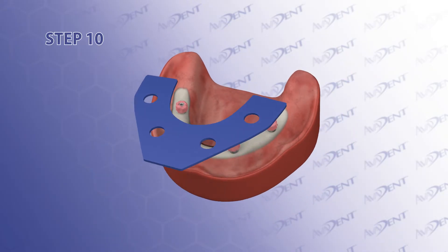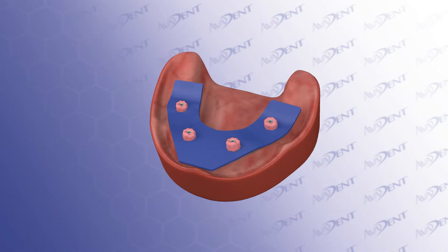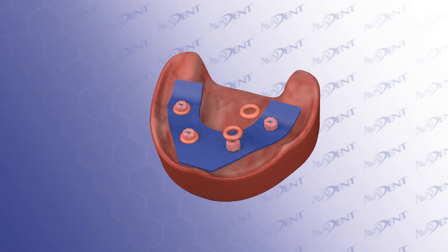Step 10. Seat the colored silicone dam over the tie bases. When done properly, there will be no or minimal bunching of the dam. Step 11. Secure the silicone dam with dam donuts from Dammit.Dental. These silicone O-rings help stabilize the silicone dam as well as block out the undercuts of the multi-unit abutments.